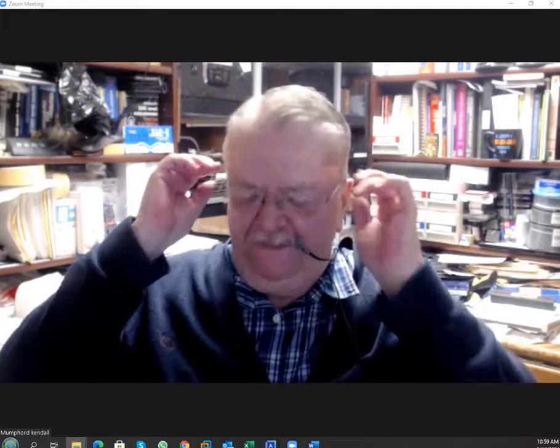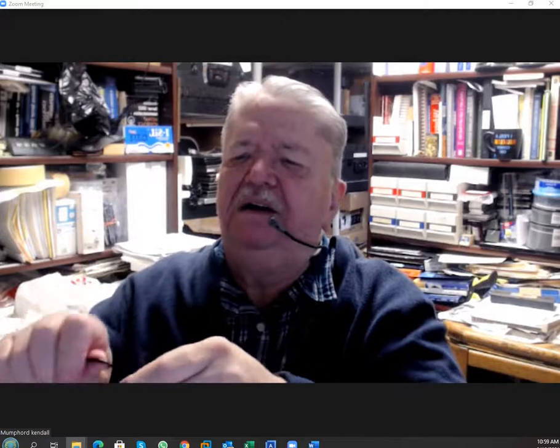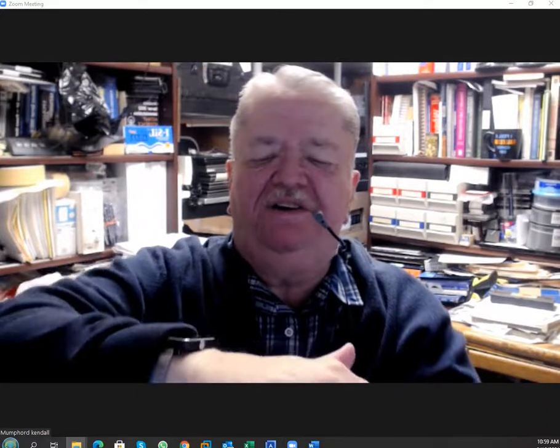Now the thing is, first of all, they're loose. They move around. To make them tighter, what I do is I bend this part right here so that it's tighter on the ears, and I'll bend it here. Generally, I do it like this. All right. Now you see it doesn't move when I move my head like this. It doesn't change at all. It stays in position.